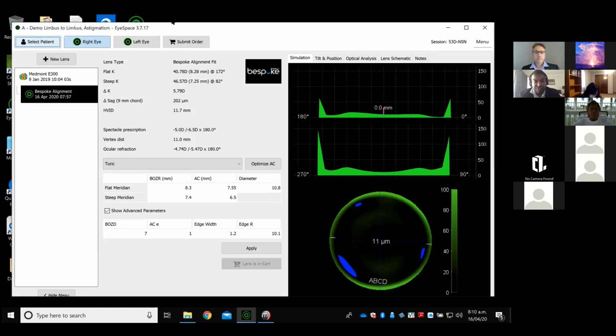So if you were to trial frame and put that residual over the top, the vision should improve. Now, obviously, we have a residual tolerance because it doesn't have to be exactly perfect in a case like this. As long as we have a reasonably good vision resulting from it, that means this is a lens that we can continue with.